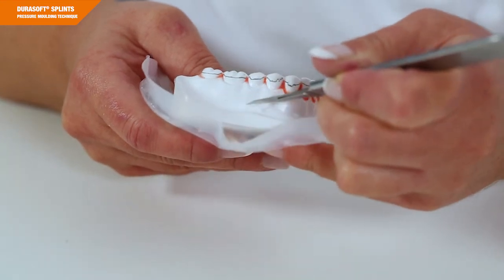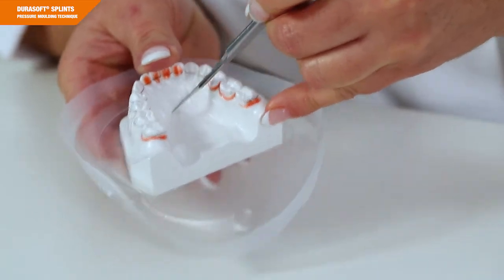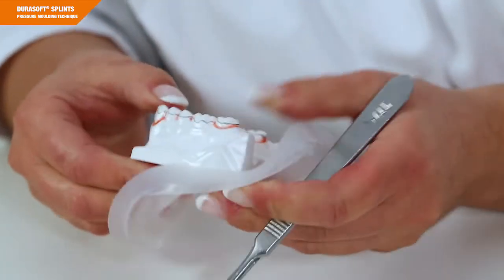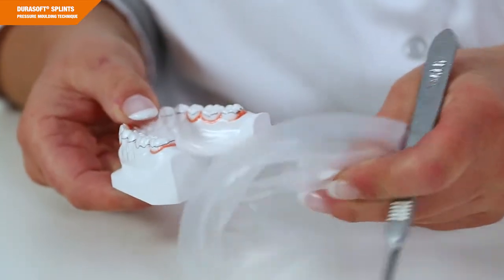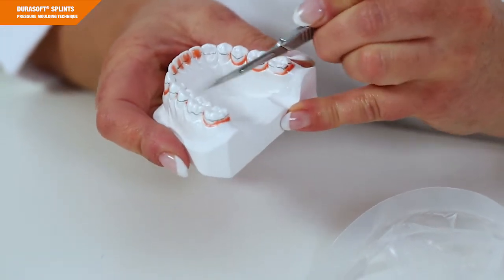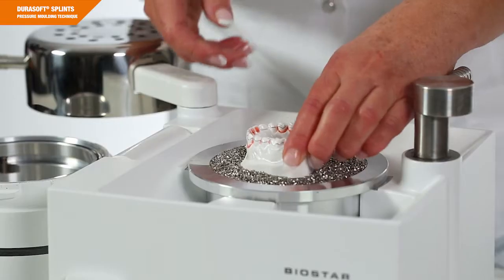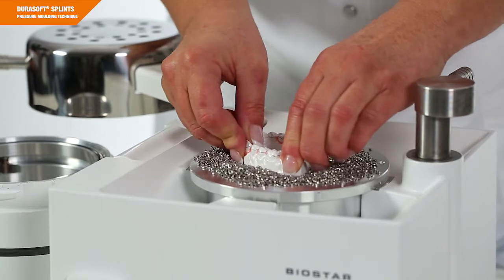Cut off the IsoFolan foil below the desired splint extension directly along the model rim. Cut the IsoFolan foil in the area of the interdental spaces with a scalpel, then embed the model with the base into the pellets.